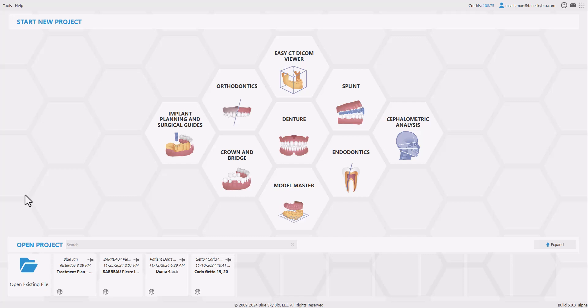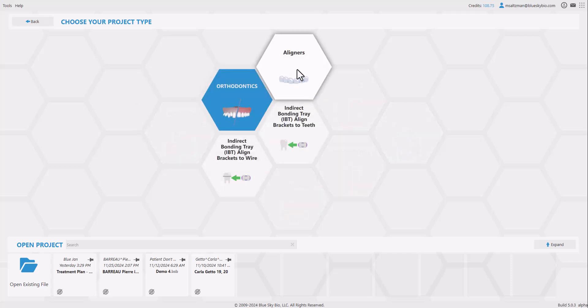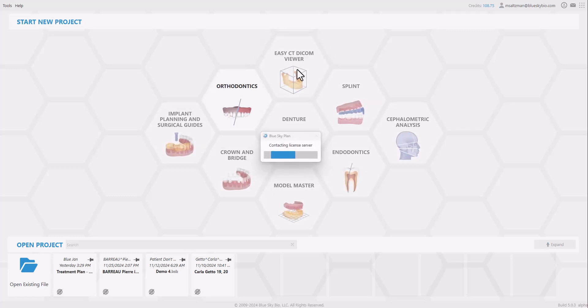We're going to start the process by loading the new data set into the software. Version 5.0 of BlueSky Plan has a new updated look and feel. We're going to start by clicking orthodontics and choosing aligners.